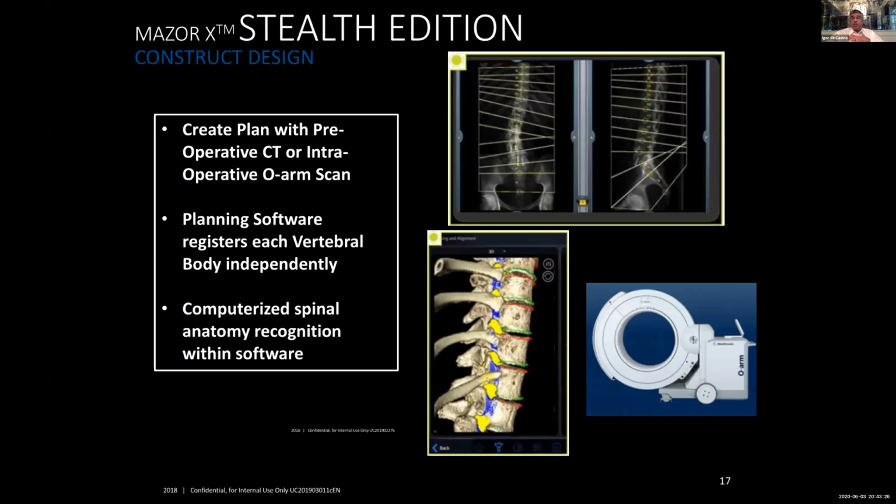All very luxury. So I tell this to everybody, I like to have O-arm, I like to have robot, I like to have navigation, but this is all luxury. If I don't have a C-arm, I'll cancel my case. Still nowadays, the C-arm is like my car. If I don't have my car, I can't go to work. If this C-arm is not working, basic fluoroscopic guidance is what I use every day.